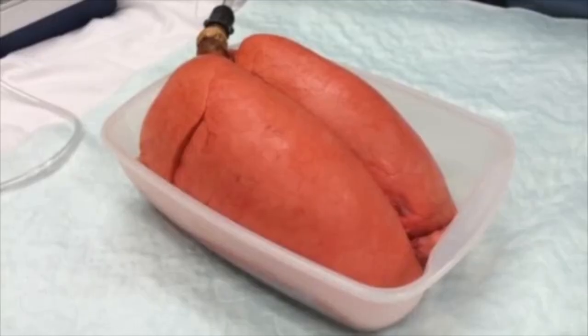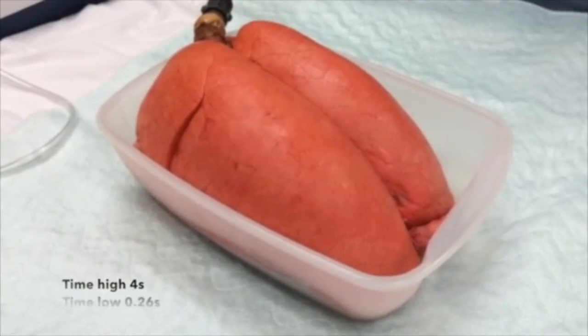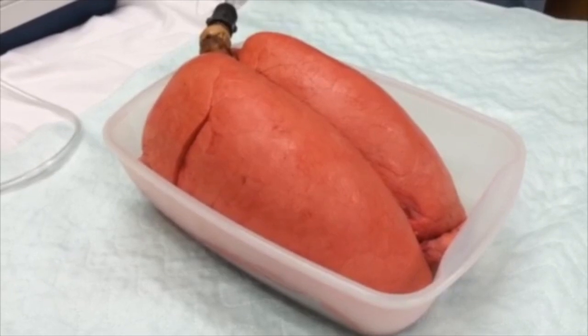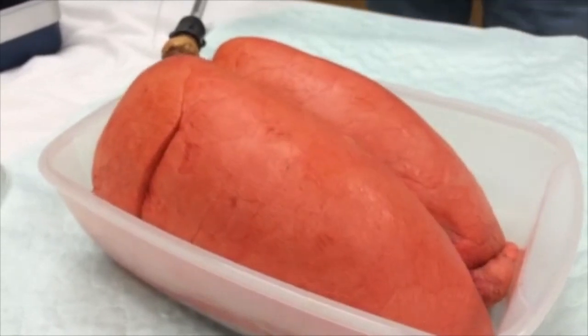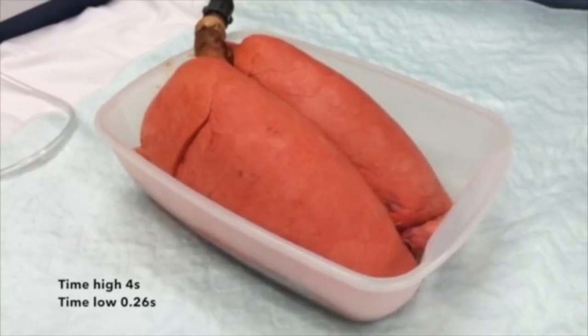With APRV, a continuous pressure is applied to the lungs for an extended period of time and then released for short periods of time. So think of it as an inverse ratio on your I:E. So if I've got continuous PIP applied for 4, 6, up to 8 seconds, and then I release it for less than 1 second, it is exactly the opposite of what you would expect to see on a normal ventilator.